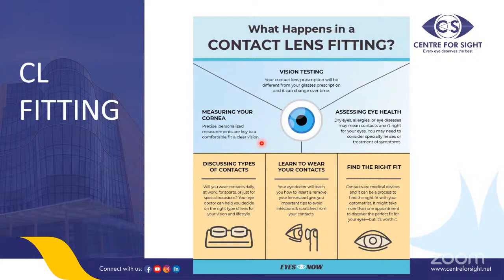Finally, it is important for the optometrist or the contact lens specialist and the eye doctor to work as a team and find the right fit for the patient with the right design of the contact lens. Only then will the patient be comfortable.